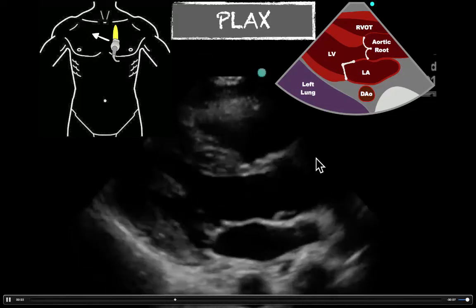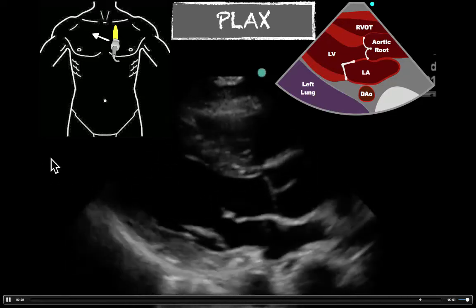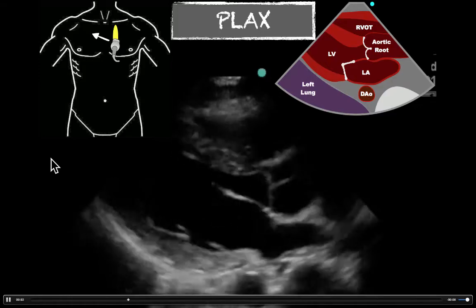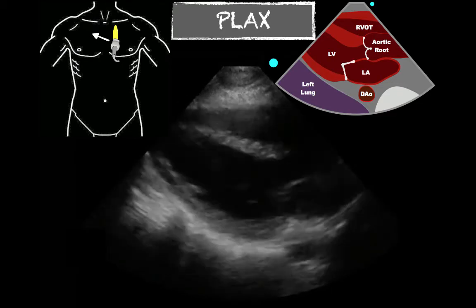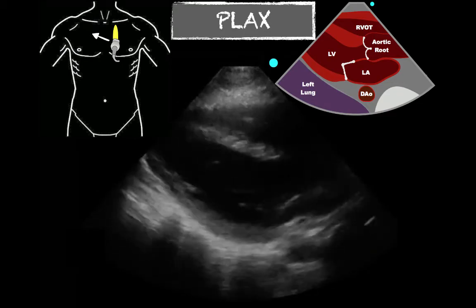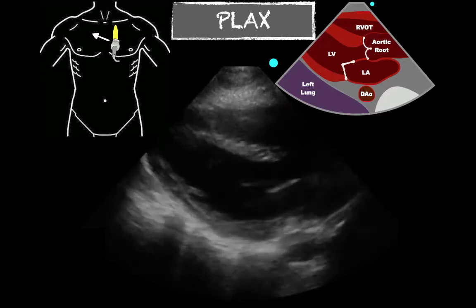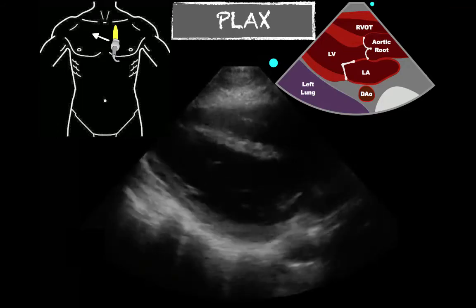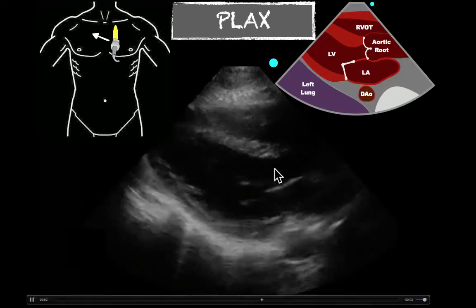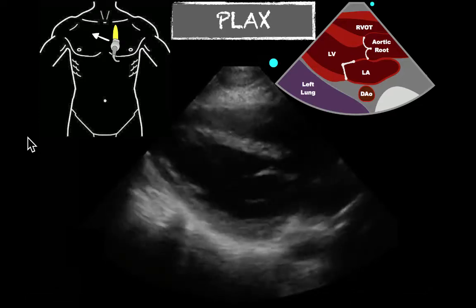First, look and see if those walls are collapsing towards each other. If they are, as in this example, you're pretty well off. In the second example, which is a bit more towards the apex, we can see the septal wall and the outer wall collapsing well towards each other — we can estimate this is a normal EF. And if we struggle with that, we can look at the valve: that anterior mitral valve leaflet is swinging up and hitting the septal wall, giving us a good idea this is a normal ejection fraction.